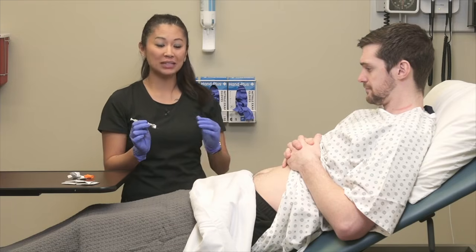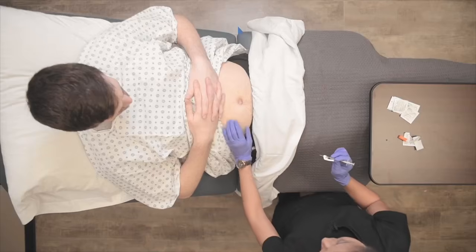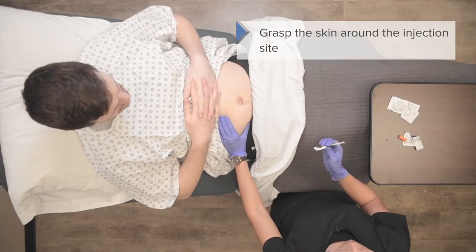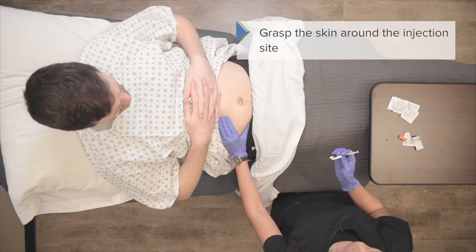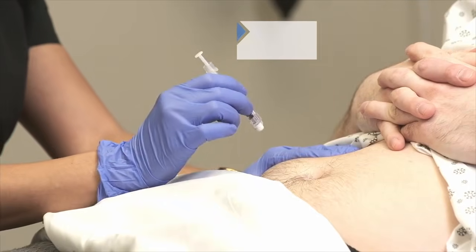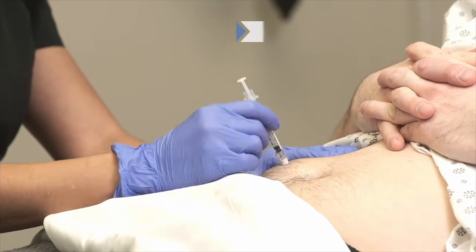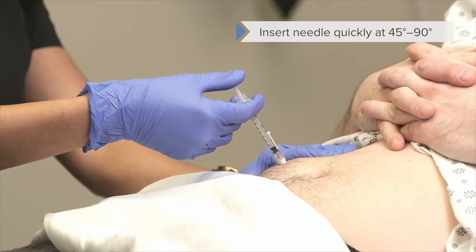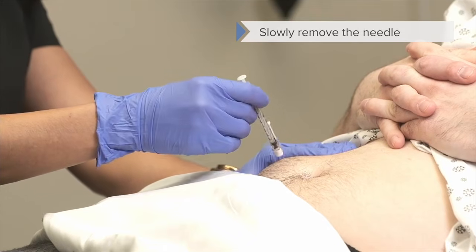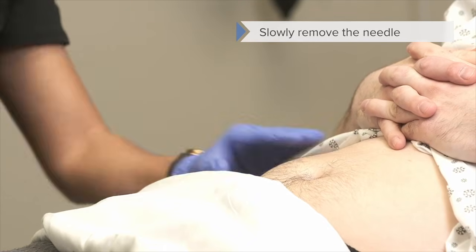All right, so now I'm going to take my non-dominant hand. I'm going to plump up the skin or the site just to give me a landmark and also make it a little bit more comfortable with my patient, and go and inject. All right, I'm going to go ahead and give your insulin, sir. So notice I darted. Then I'm going to inject my medication, and now I'm going to slowly remove it, and then I can release the skin.